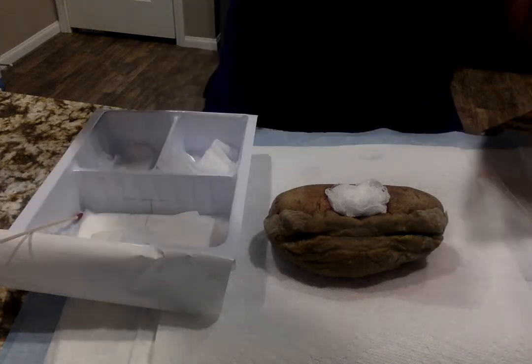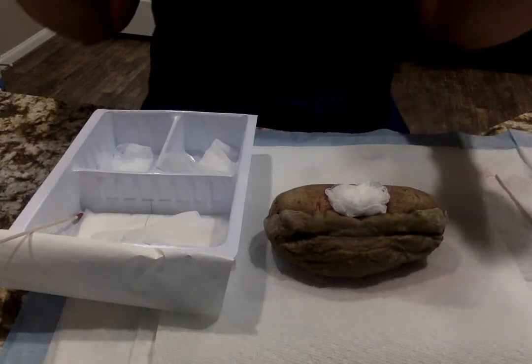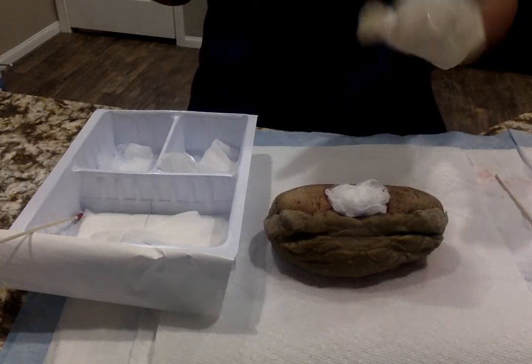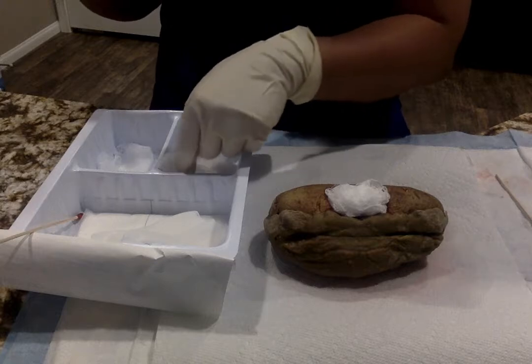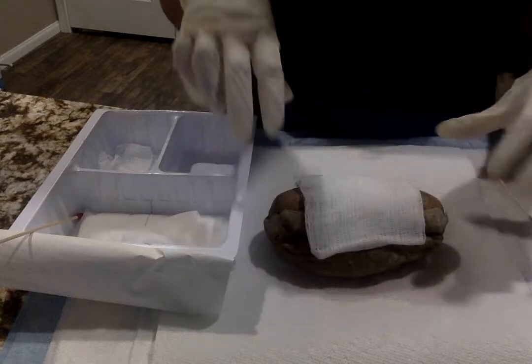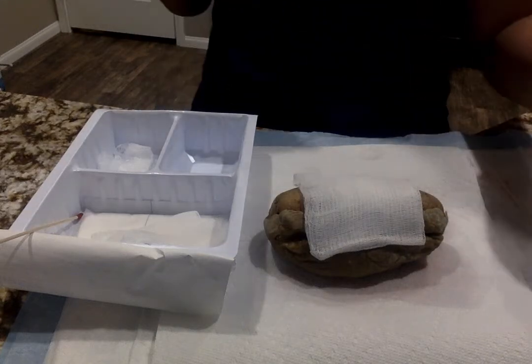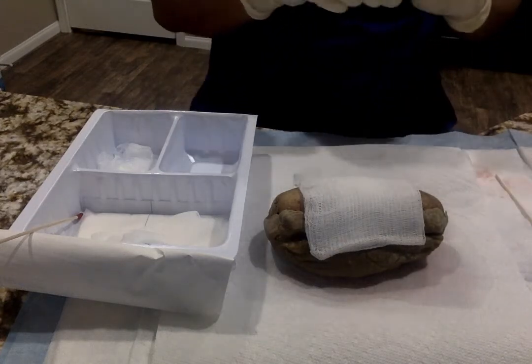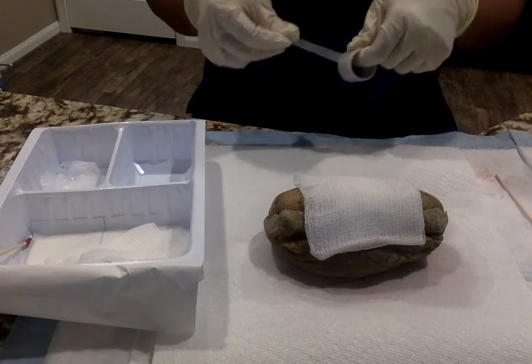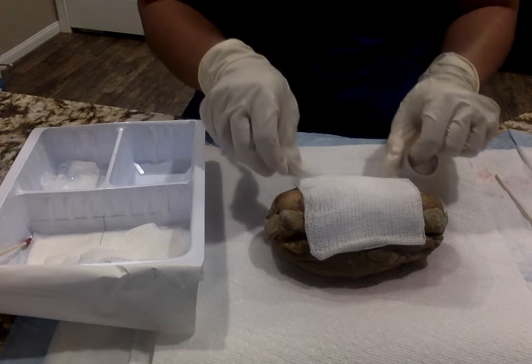I'm not going to move the computer. It's going to stress me out. So I'm going to just leave it like this, and I'm going to place the sterile 4x4 over it, and I'm going to get my tape and start taping up the wound. It's going to be half on the tape and half on the skin.